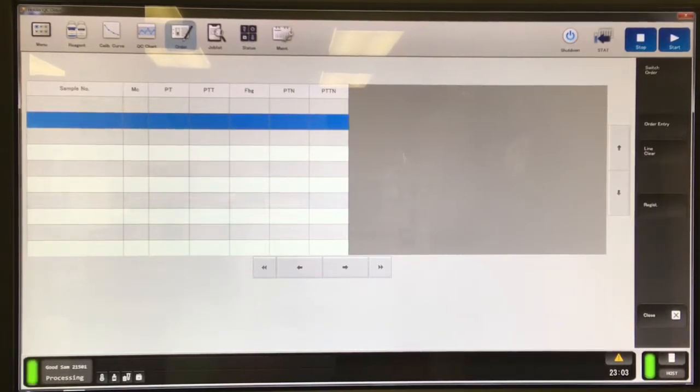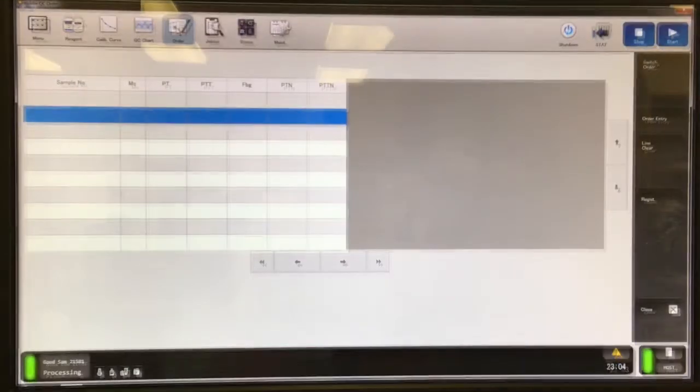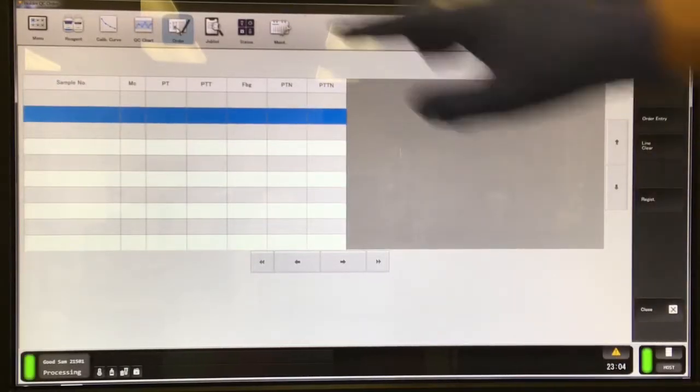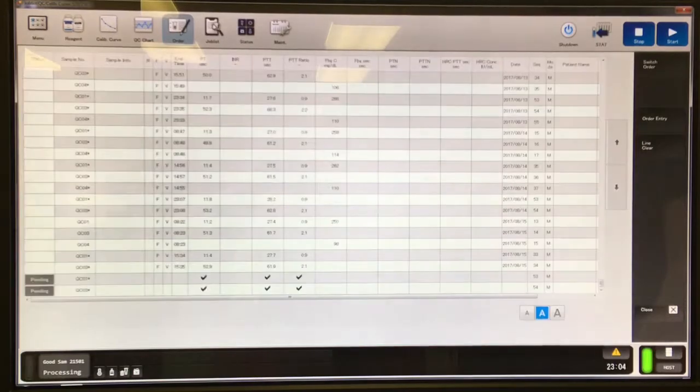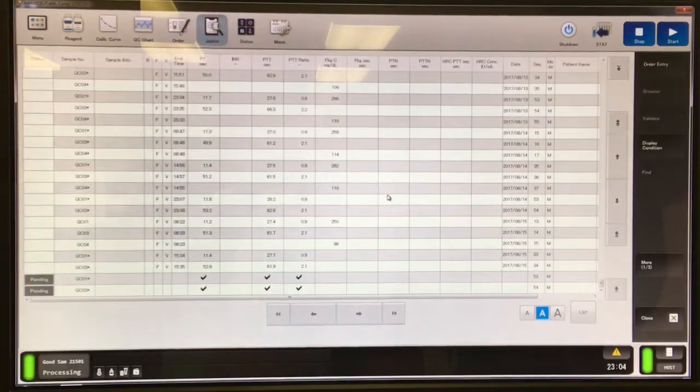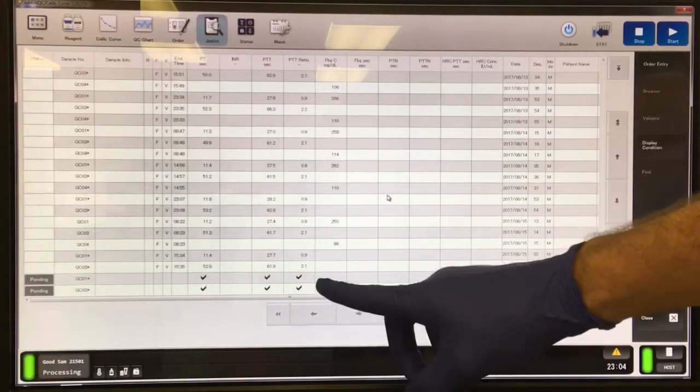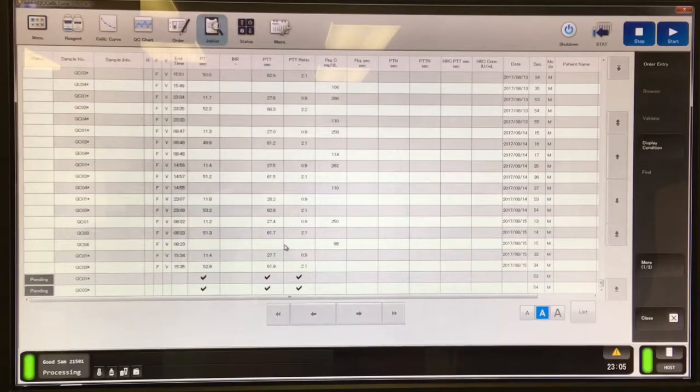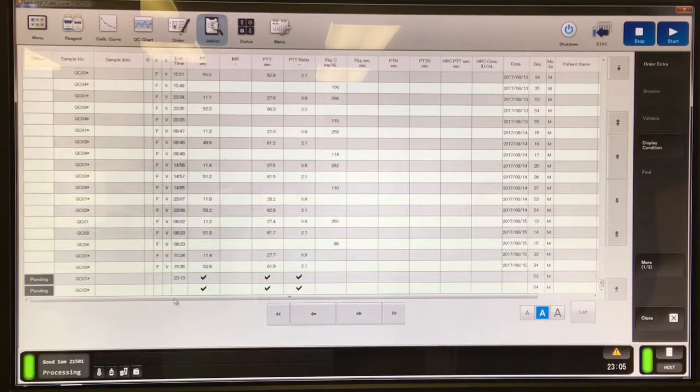Then we're going to go to the job list. We can use the quick tabs area to do that. I have all my QC showing down here at the bottom where you can see the different analysis progress indicators.